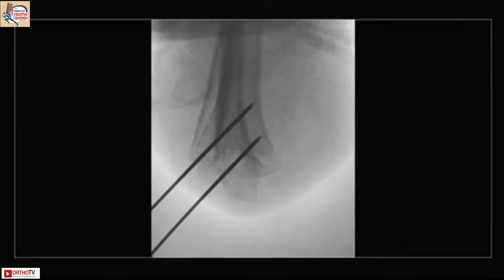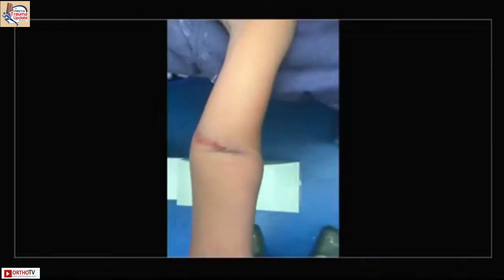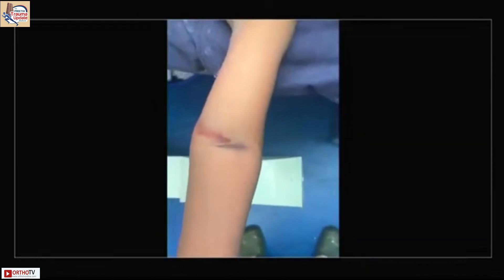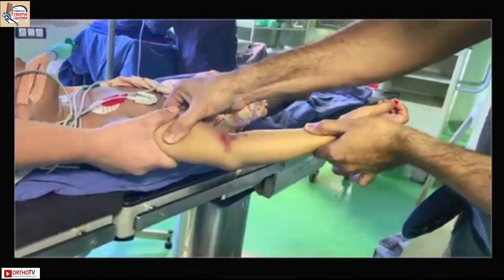If you are happy with two pins you can stop; otherwise add an additional pin if you feel it is unstable. I then move the elbow through range of motion and check. Sometimes you get the pucker sign and that can be dealt with by milking the anterior muscles — the brachialis — to dislodge them.